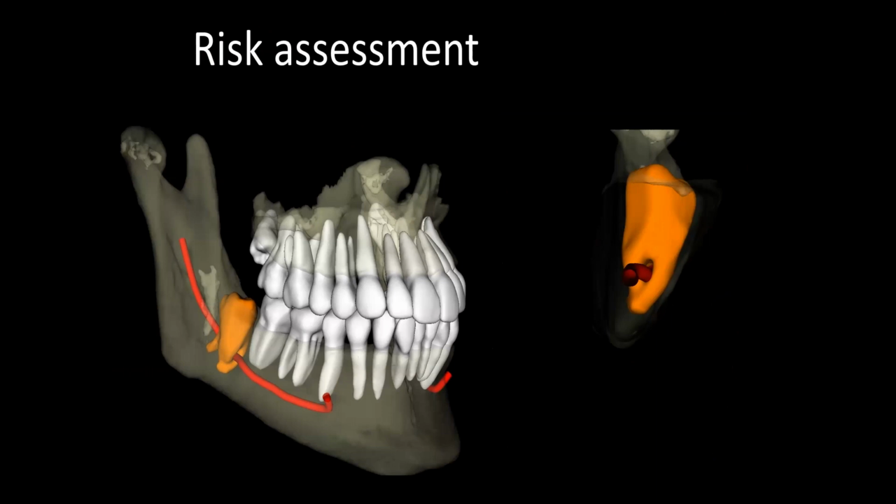Nerves, this is very important for the adult patients who never had their third molars removed. In our office, we are big fans of early removal or early enucleation of third molars when you think about the risks of a fully impacted, fully developed third molar in relationship to the nerve. There's a lot of unknowns on a 2D Panorex. So that's why the oral surgeons make you sign a boilerplate informed consent about a nerve injury.